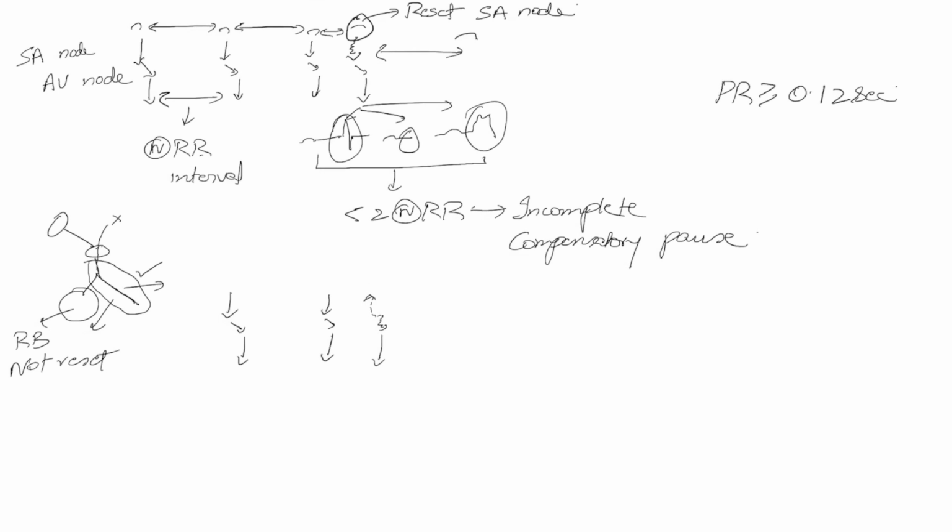So if this is the case, the QRS that you see could be one of the three scenarios in the PAC. So it could be a normally conducted QRS, which is normally the case, or you might not see the QRS if the junctional beat is happening too early, or you might see it at a point when a part of the ventricle is still refractory, in which case you would see a bizarre looking QRS. You might also see a compensatory pause that's incomplete. But one thing you would notice is based on the origin from the AV node.